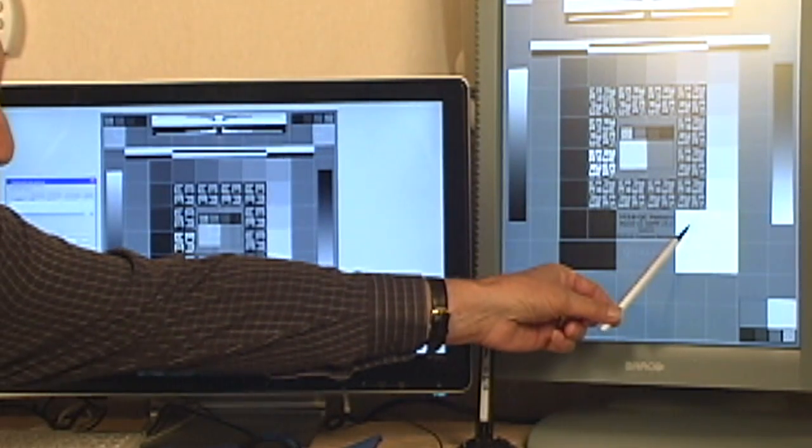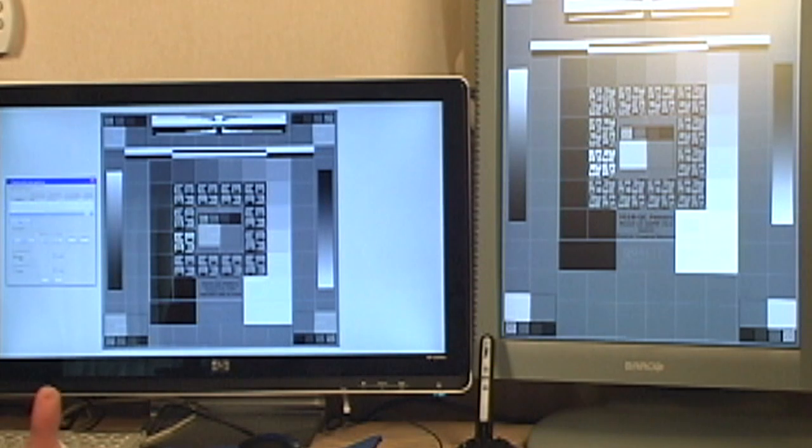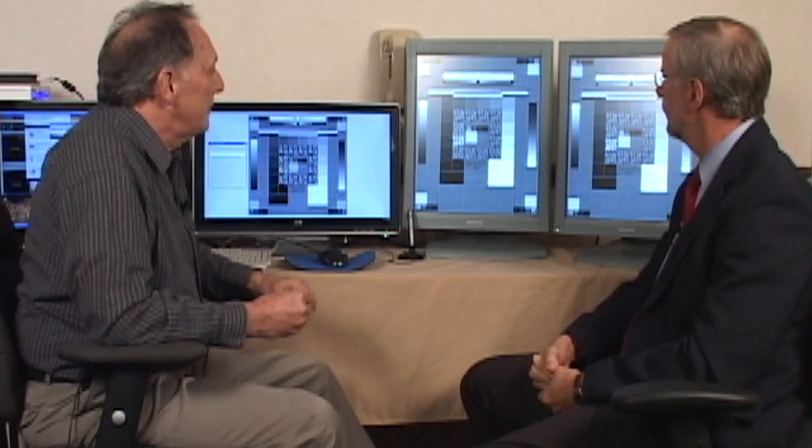Both of these squares are the same number of digital driving levels different from their background, which turns out to be 13 digital driving levels out of 255. If you think about that in terms of the typical medical display, that's roughly equivalent to at least 26 just noticeable differences. So they should be very visible to your eye. There should be no question in your mind that they're there. By the way, we don't see them as prominent right here because of the lighting and camera. Your typical viewing distance for this would be roughly 0.6 meters for good viewing.